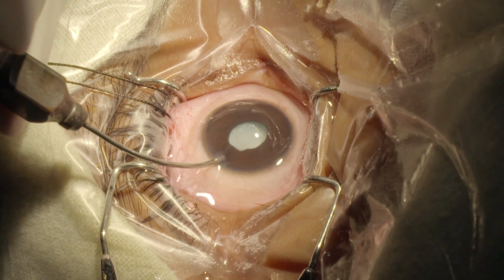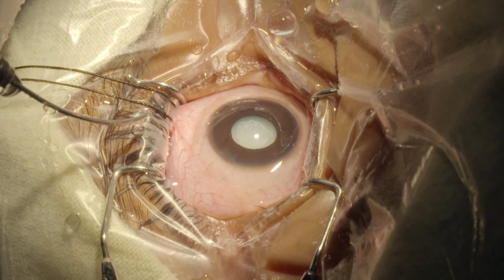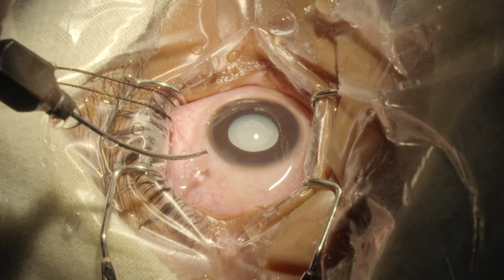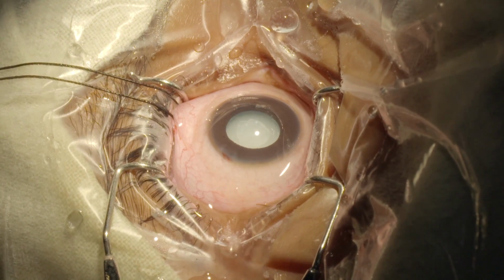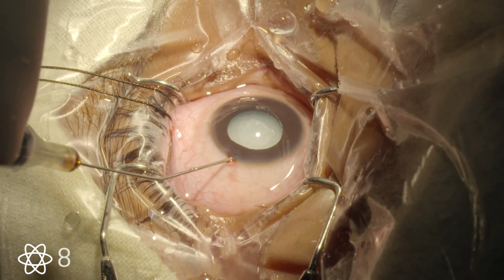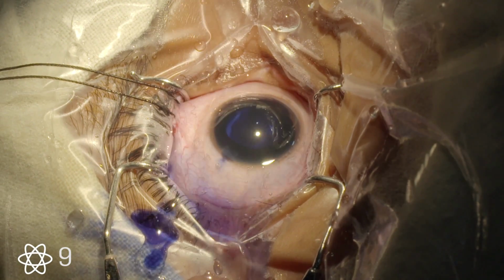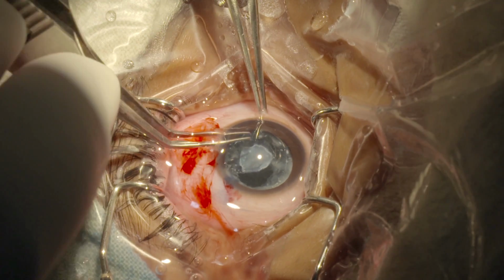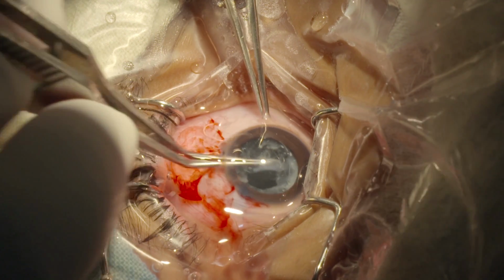Now again, this footage is not for the faint of heart. Check out the cataract, that's the white disc in the middle there. Majidul has been put to sleep, although you can also have this procedure using just a local anaesthetic. The surgical team needs to hold the eye in place, and they'll also give the patient eye drops to widen or dilate the pupil. In this case, they've also added dye to help them see the lens capsule. Then the surgeons reach in and gently remove the lens, being sure not to leave any bits behind.